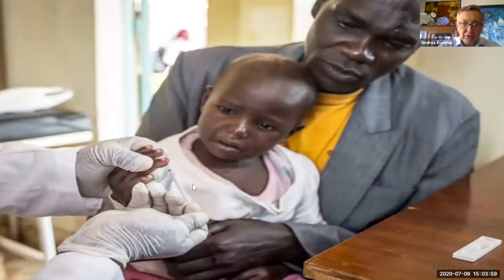So I'm asking you, what is this instrument? If you can put in the chat box, can you let me know? What is being used? Can you see on the photo, what is this little plastic instrument? Inverted cup. Dr. Salahuddin, thank you very much.